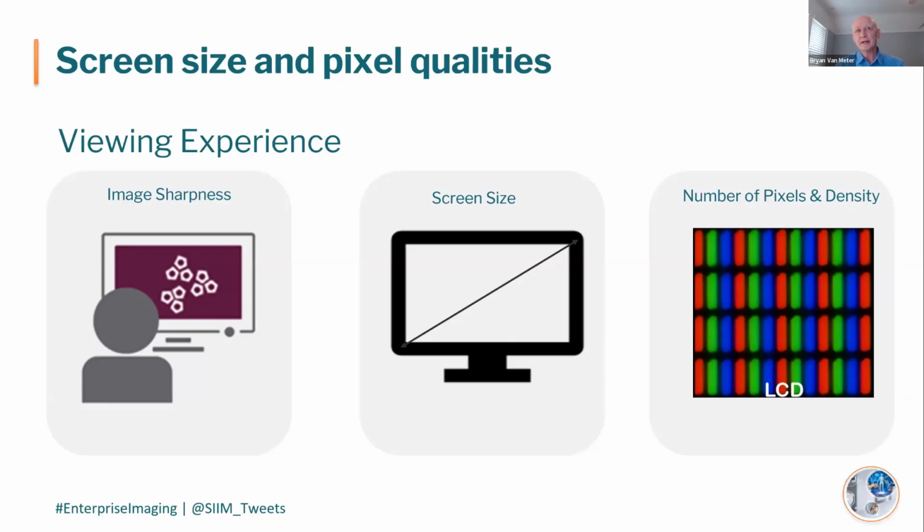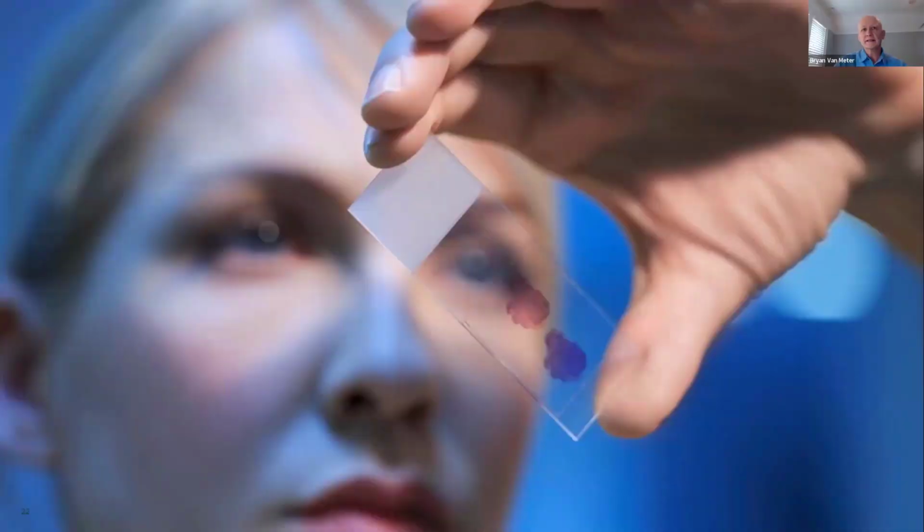They're actually dependent if you try to look at image sharpness, clarity, or visual acuity. And there is no specification for image sharpness. It becomes something about the visual perception that you see as the user. And the eye determines in a lot of ways what resolution is, not the actual number of the individual display. And I'll demonstrate that in the next area.